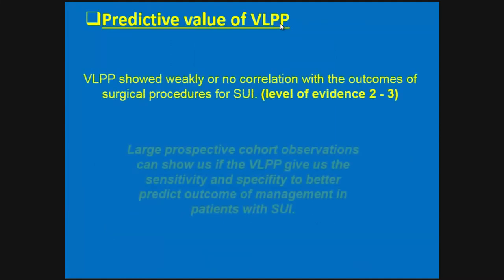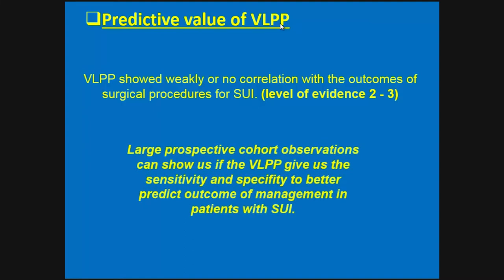What is a major point is the predictive value of the Valsalva leak point pressure. It shows weak or no correlation with the outcomes of surgical procedures, and this is present in several studies with not so bad a level of evidence, 2 or 3, but we do have to admit that in those studies the way that the Valsalva leak point pressure was finally described is not the same.